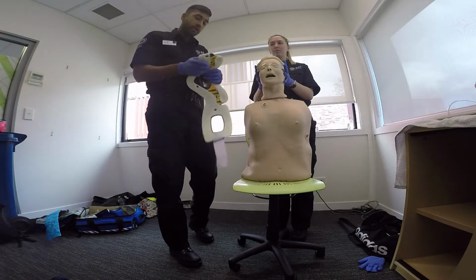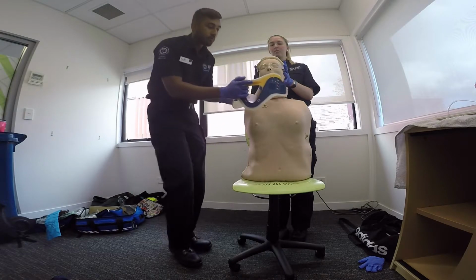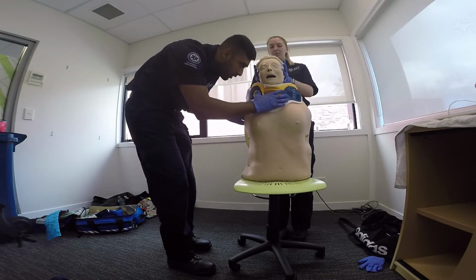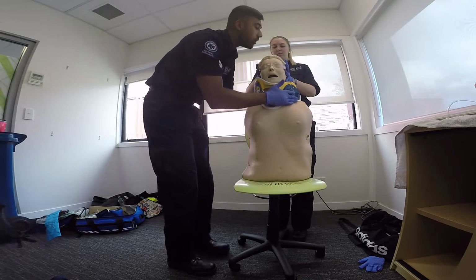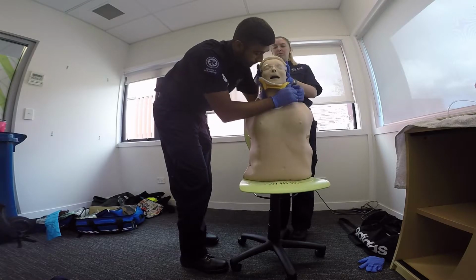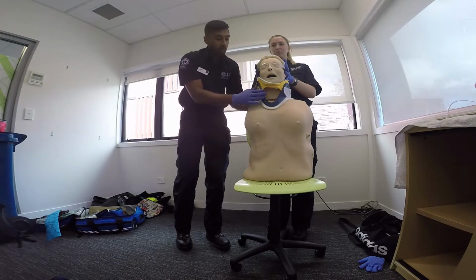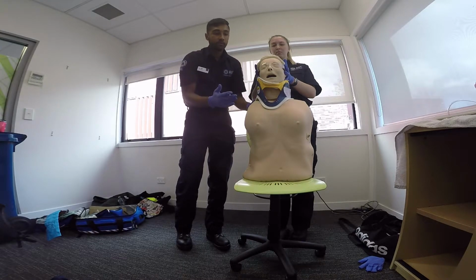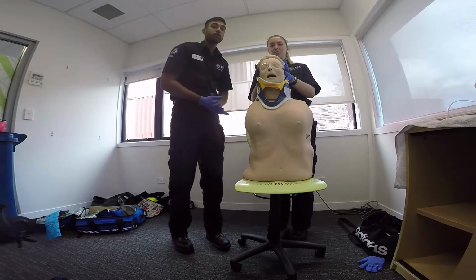Right. And what I've done is it's a good idea to actually pre-bend the collar itself, just so it helps with placing it on the patient. Like so. Okay. Collars only reduce a small amount of movement, so until the patient is fully secured, it's always a good idea for you or your colleague to continue holding the head.